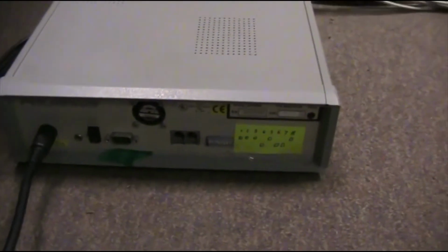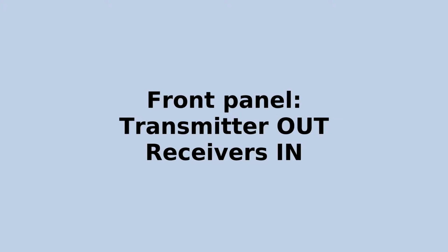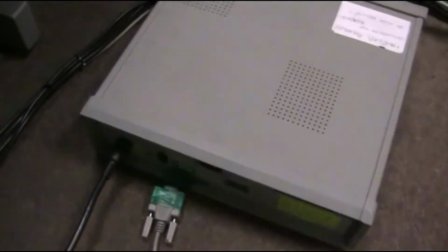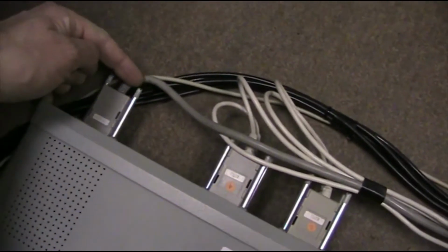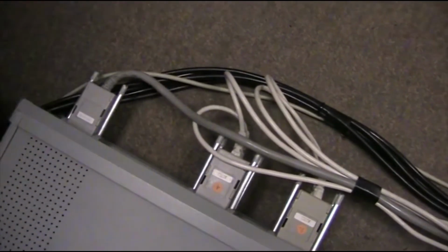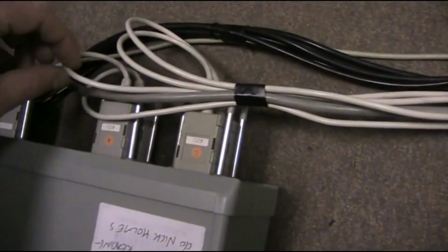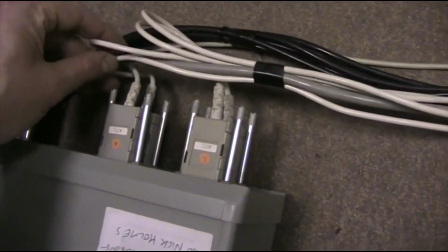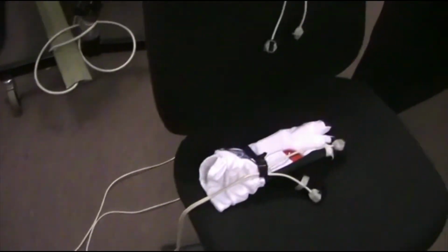On the back panel you have the power cable and the data output cable labelled RS232, and that goes to the laptop. And on the front panel there's one large cable which goes to the transmitter, and 4 smaller cables, one for each of the motion trackers. And these 5 long cables are arranged very neatly, and they go around the lab in one bunch.